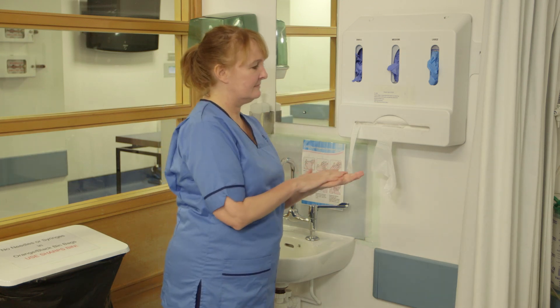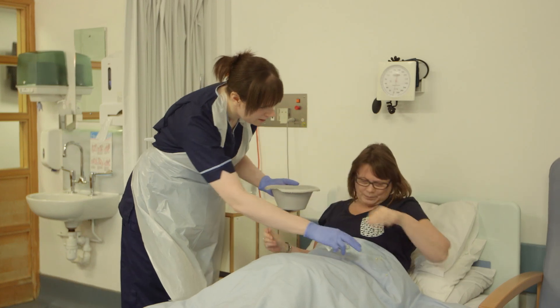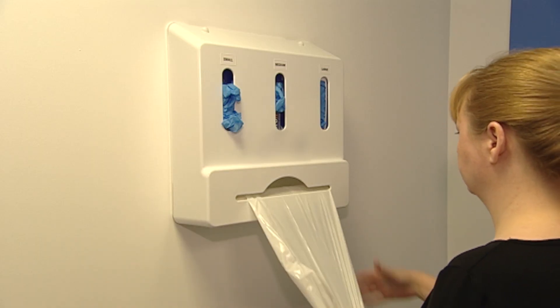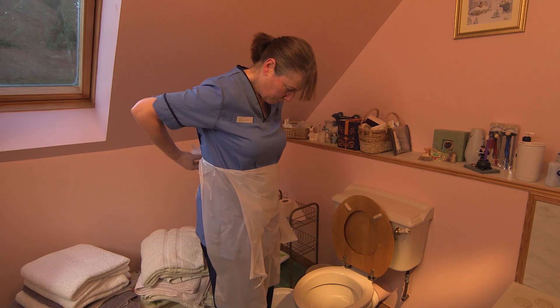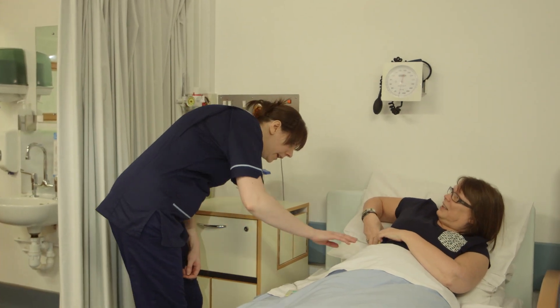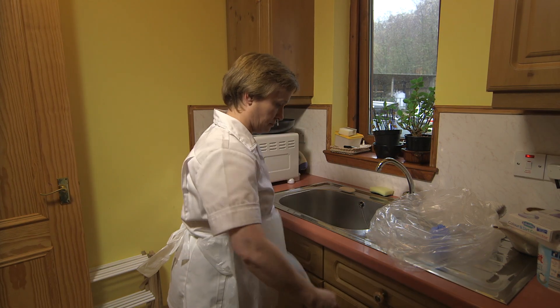PPE is vitally important in all health and care environments to reduce the risk of contamination and infection. PPE is effective only when it is applied, worn, removed, and disposed of correctly. Assess the activity to be undertaken before donning PPE, and remove it as soon as it is no longer required, then perform hand hygiene.